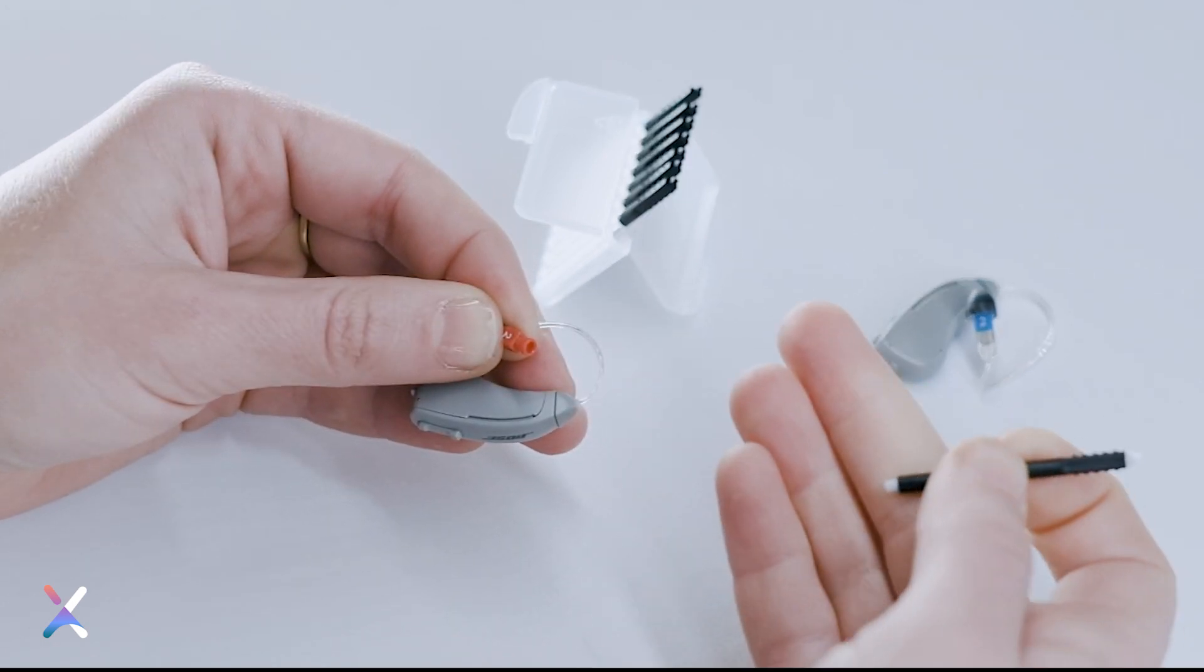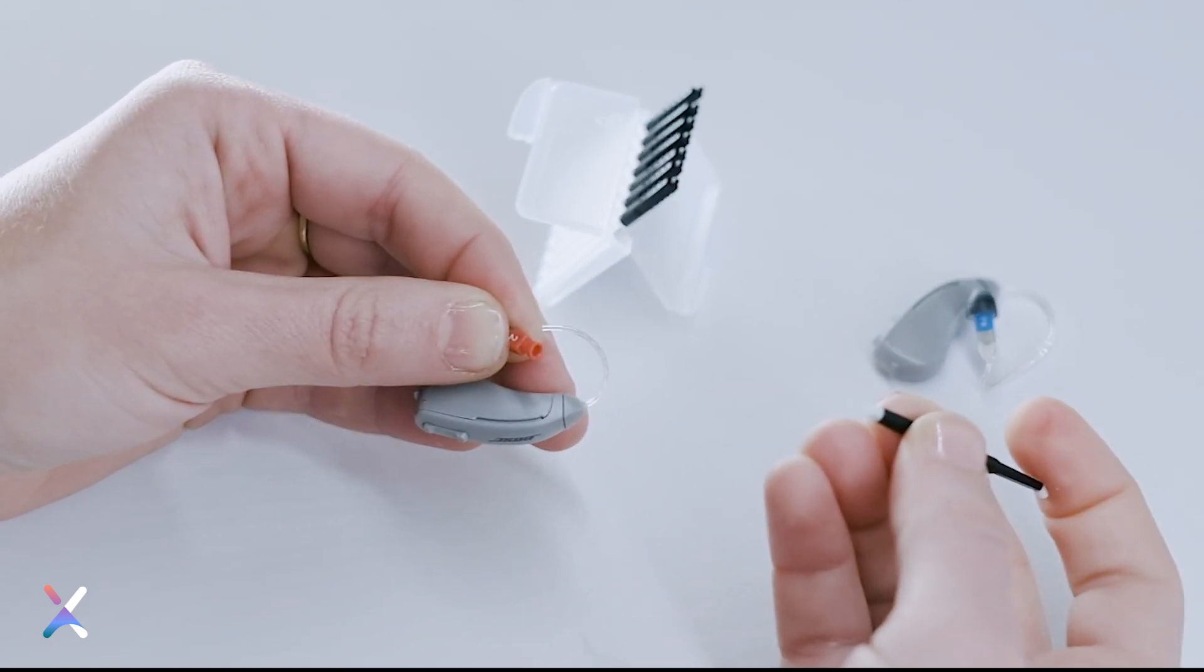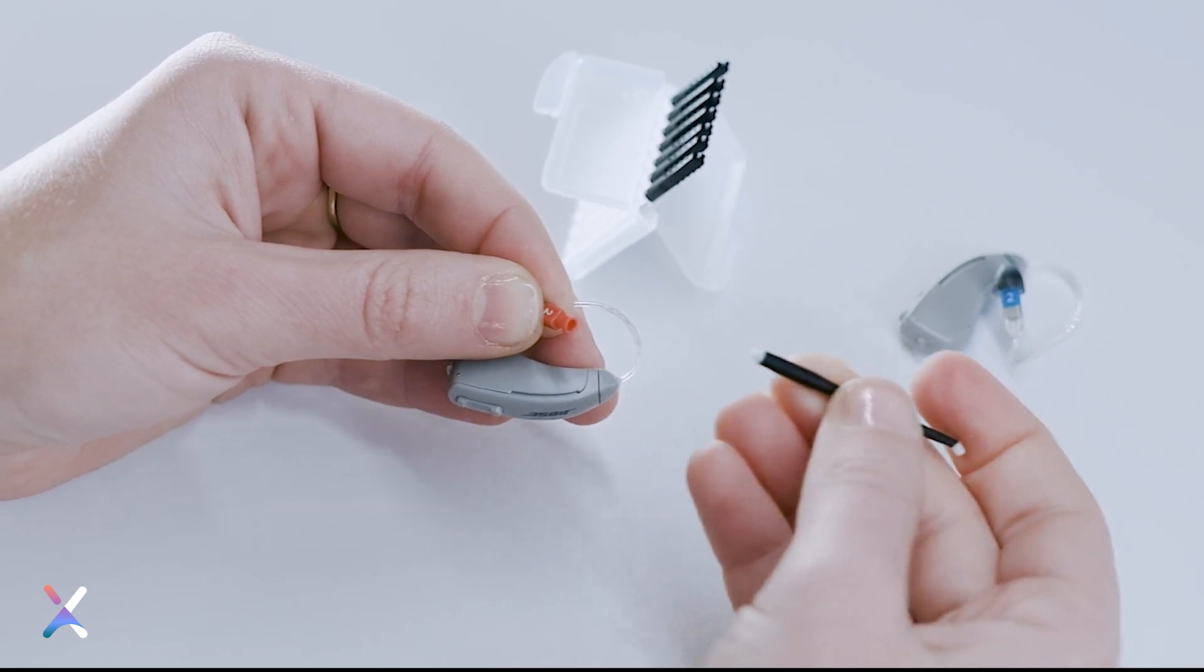Then pull back to remove it. Pick up the new wax guard and insert the larger white end of the wax guard tool into the center of the new wax guard.